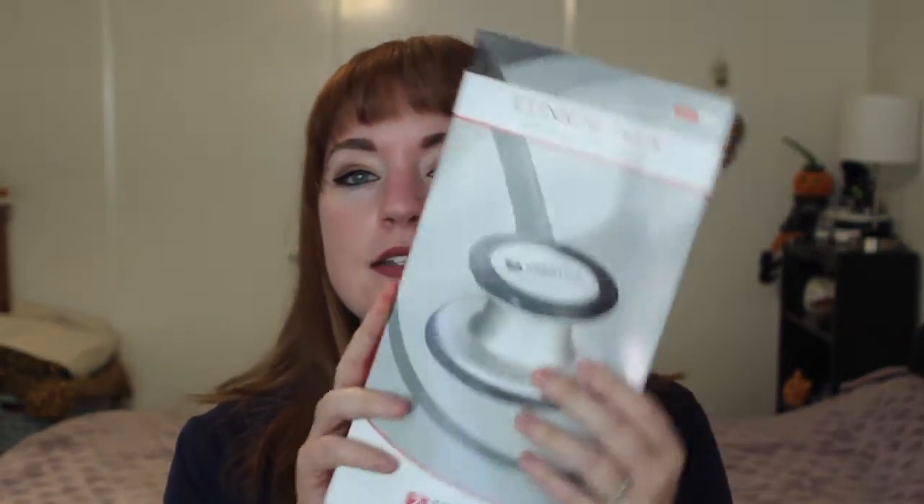Hey guys! I'm back with another stethoscope review. I know that's all you've been getting is stethoscope review videos, but this will be my third stethoscope review from companies who have sent me their stethoscopes. I don't know if there will be more, but if there are, I will post them, do my review, and tell you what I like and don't like about them and the specs. So today I will be reviewing the Prestige Medical Clinical Plus stethoscope.